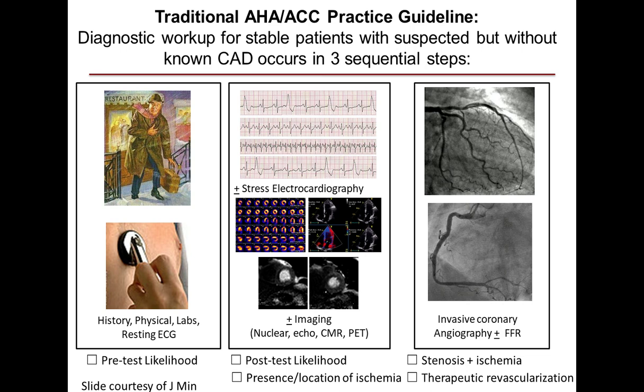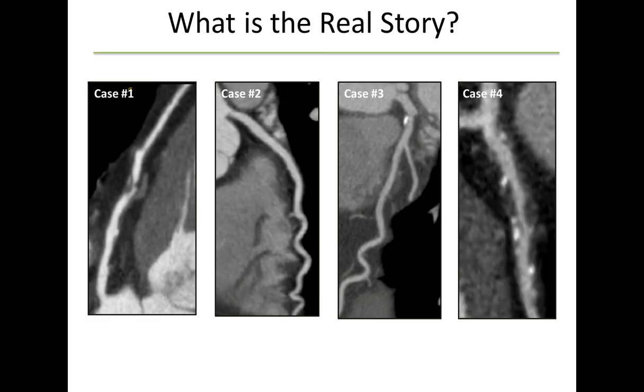And we do CT angiography following stress testing historically, and we would find cases where we'd find high-grade anatomical stenoses, or we'd find patients that had absolutely no atherosclerosis, or very minimal atherosclerosis, or very aggressive atherosclerosis with both high-grade stenosis and extensive non-calcified plaque with spotty calcification, positive remodeling, and low-density plaque.